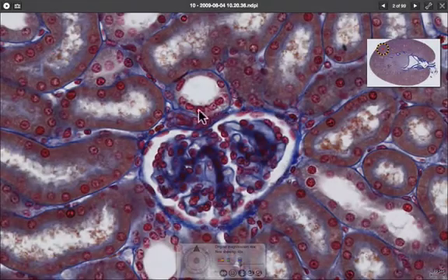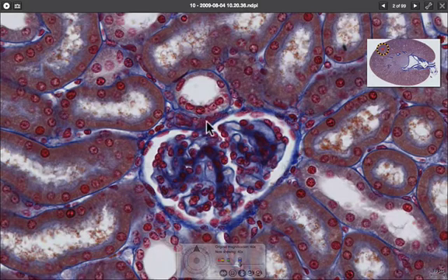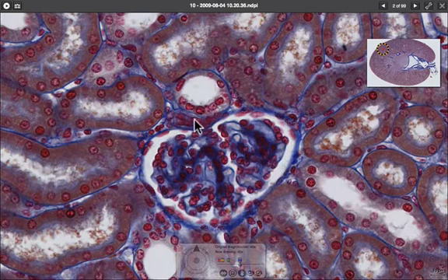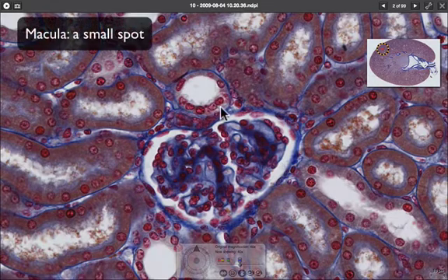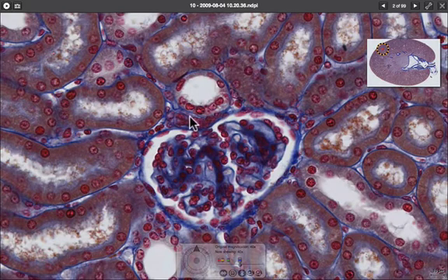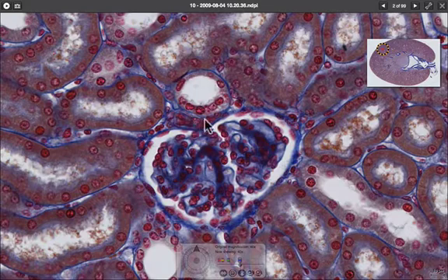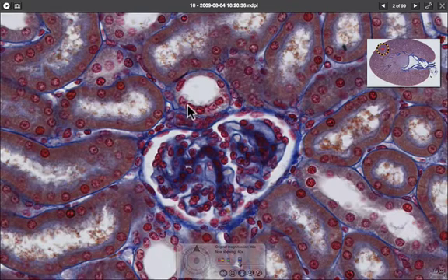Looking at the cells lining the distal convoluted tubule, the nuclei are very close together where it butts up against the afferent arteriole. This is the juxtaglomerular apparatus, where cells called macula densa cells detect sodium levels in the filtrate and work together with pressure-sensing cells in the afferent arteriole. Together they decide whether to release renin — and that is how the renin-angiotensin-aldosterone system works.